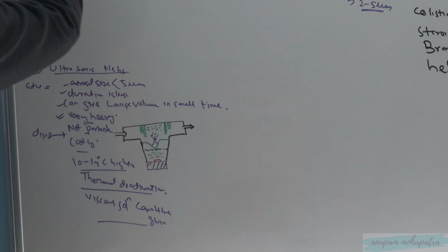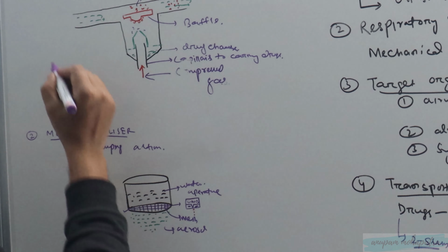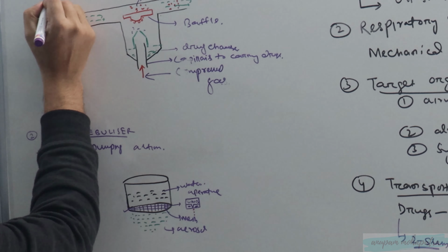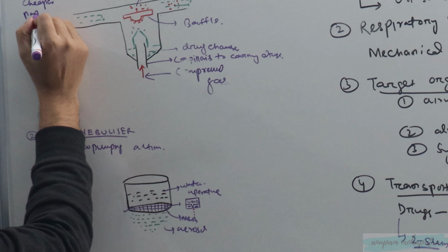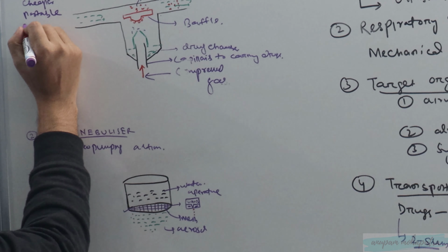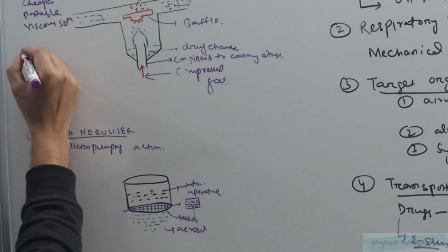Right. What is the advantage of jet nebulizer? Advantage will be cheaper, portable, good for viscous solution. What is the disadvantage?